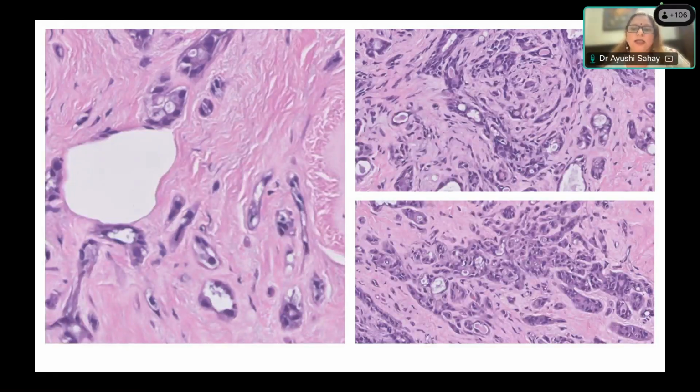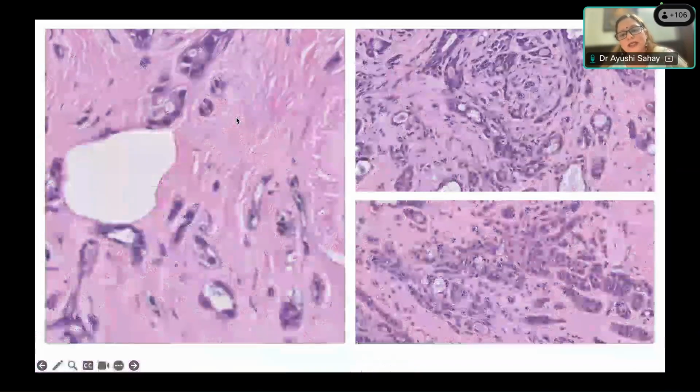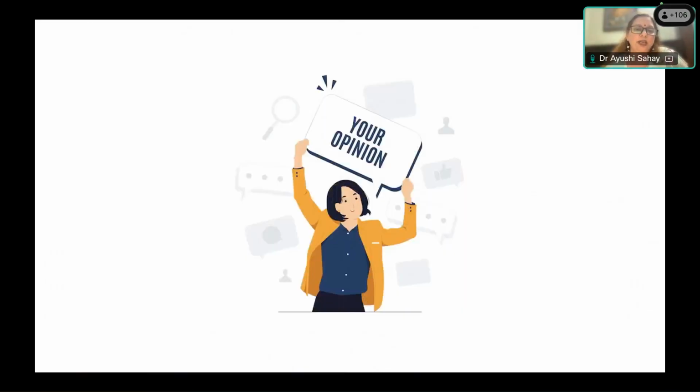So first thing first, you have to do myoepithelial markers to check whether these areas are invasive or not. He thinks that these infiltrating looking, angulated arrangements are because of sclerosing adenosis, because you are having hyalinization of stroma in between these ducts, which is causing these ducts to become elongated, narrow, compressed. And as I said, you can see a large duct branching off into smaller ducts, which is the arrangement of a TDLU. So yes, first thing you need to confirm, and many times it is a very common differential of an invasive carcinoma. So in such cases where you have confusion, you do need myoepithelial markers.